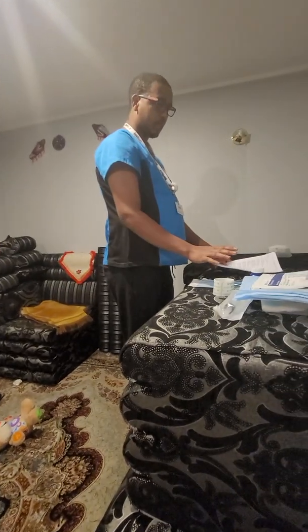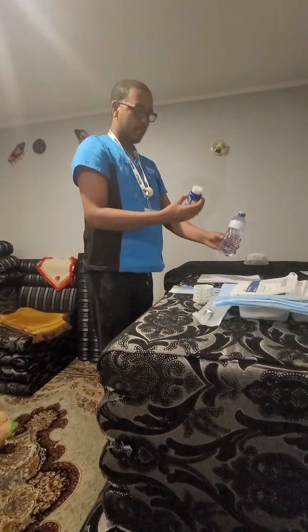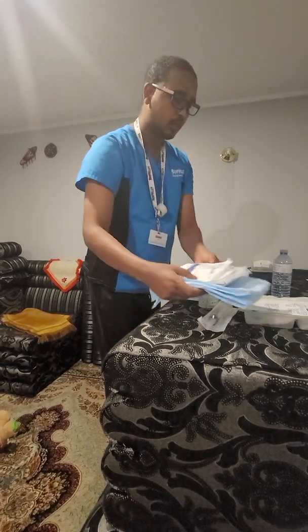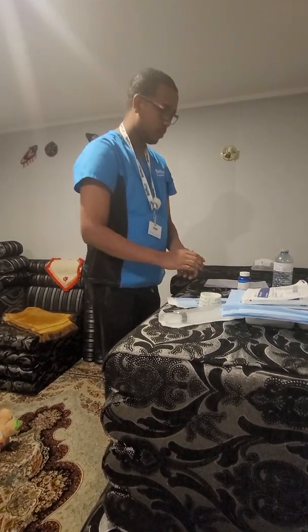So these are my supplies. Before that, I'm going to do my three checks on my normal saline and steri strips. So these are my supplies, and I'm going to do three checks.